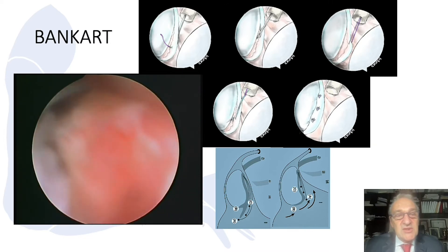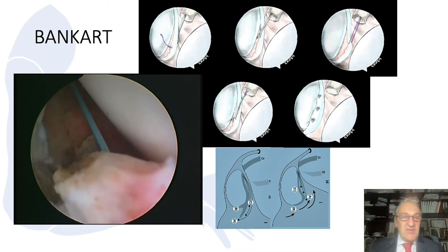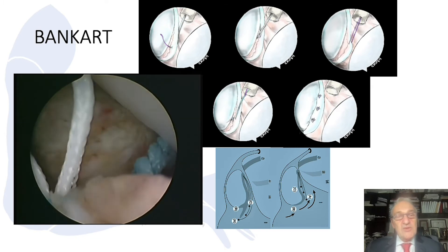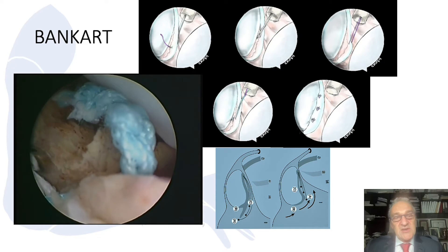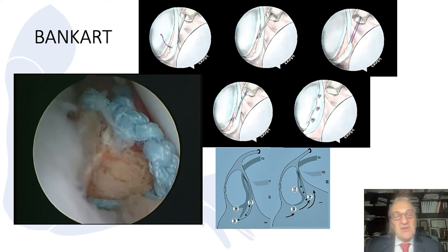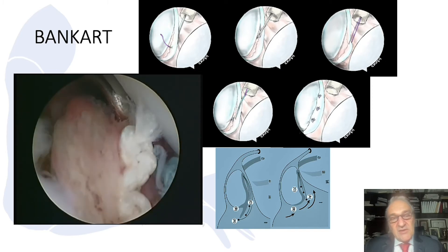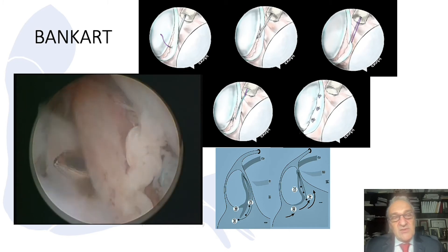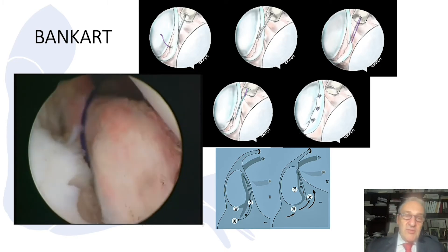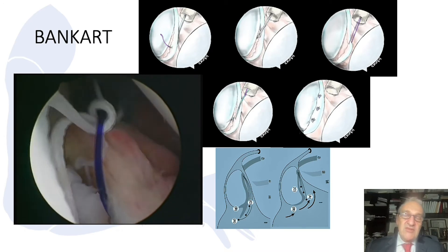I use the PDS suture shuttle. You can see with this inferior suture, I suture it. There are two kinds of anchors on the market: double loaded or single loaded. I prefer double loaded because sometimes I like to do two sutures from the same anchor, or as a sense of security, if I fail with one suture I can use the other. We aim for three anchors total, starting with a traction suture.